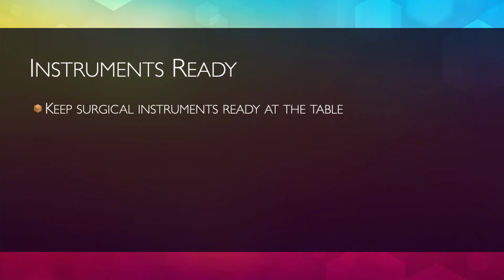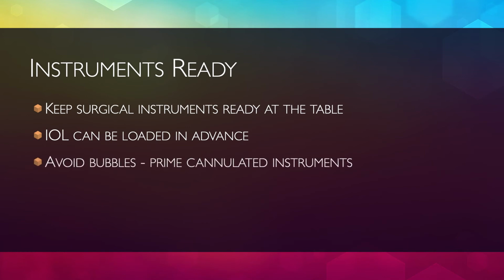Keeping everything ready and at hand optimizes surgery flow and greatly reduces idle time, facilitating subsequent recording editing. Please keep cannulated instruments primed. Bubbles are one of the most annoying and unsightly things when watching surgery videos.